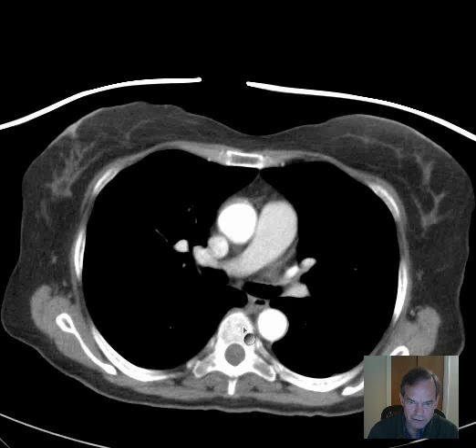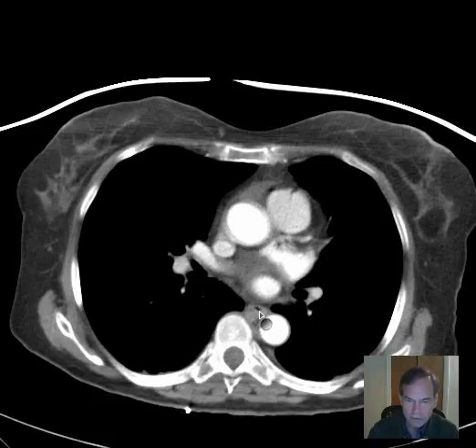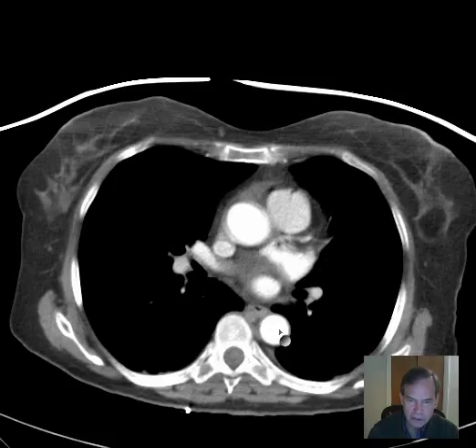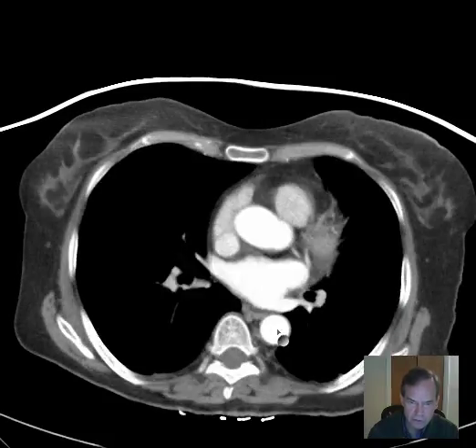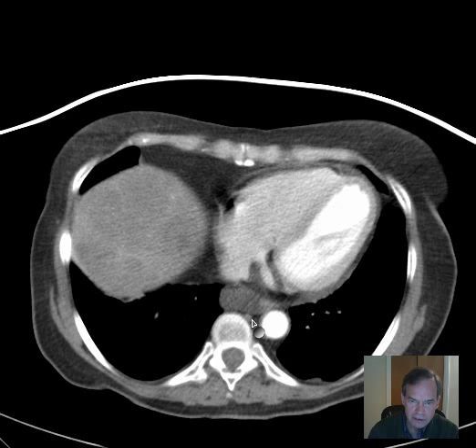Follow that down a little bit farther. Here we have a little air pocket that is the lumen of the esophagus, immediately adjacent to the descending thoracic aorta. And that looks fine — no obvious mass there.